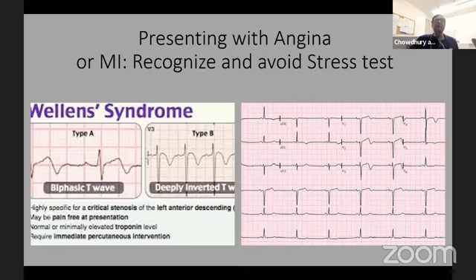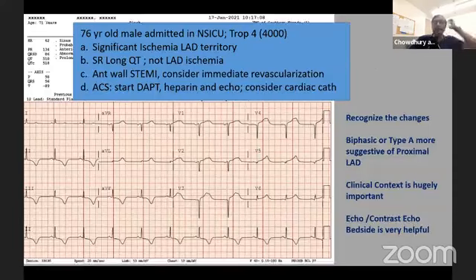But in the emergency room or in your hospital, coming with this typical 10 out of 10 chest pain and this evolving EKG, this is typical of proximal ostial LAD. Very high risk patients. This patient should never go to the treadmill test. And I give you this scenario.